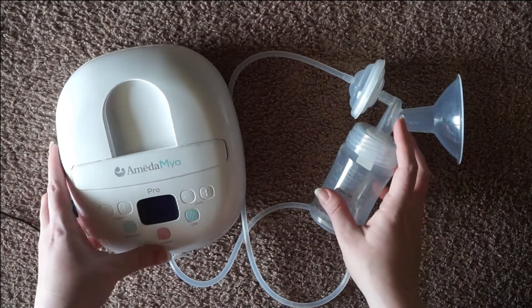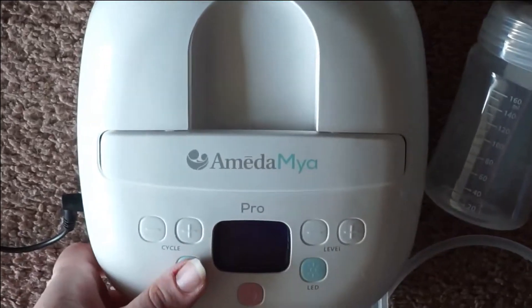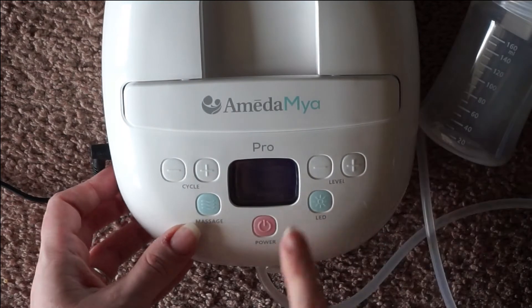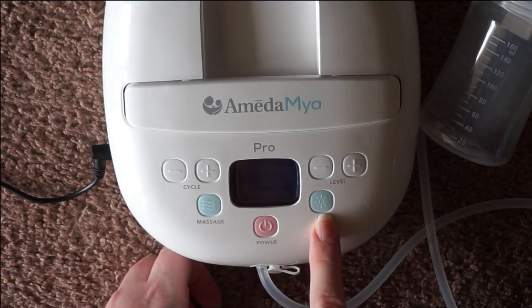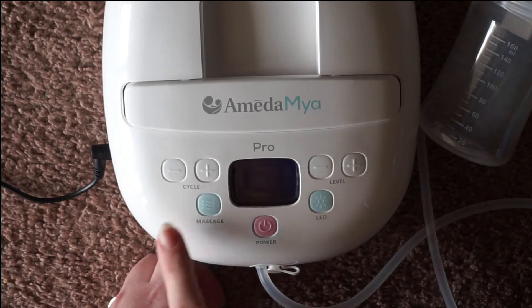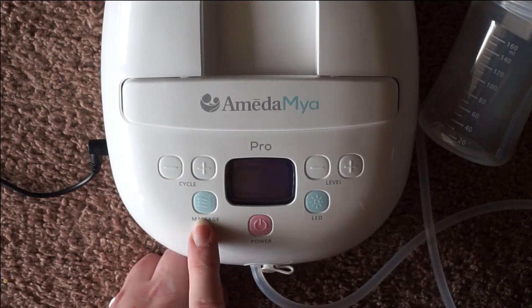As far as how to use this pump, let me go over the buttons here. On the front you have your power button, your light button, the different suction levels, the frequency rates, and then also the ability to interchange between massage and expression mode.